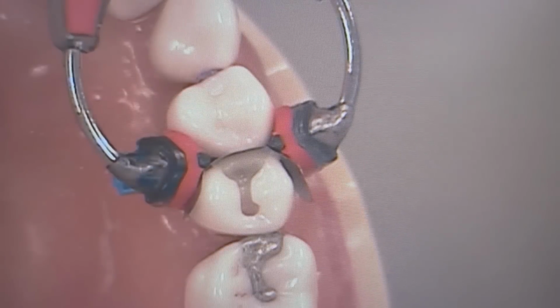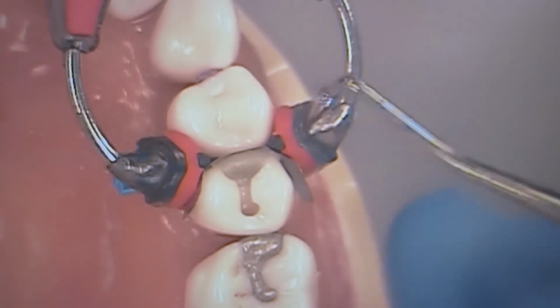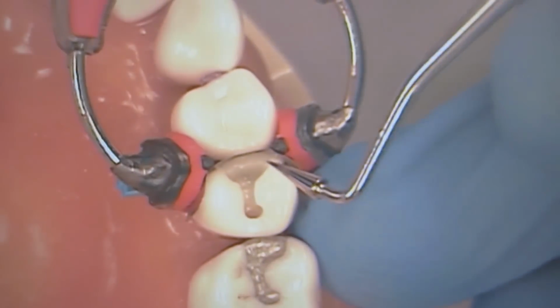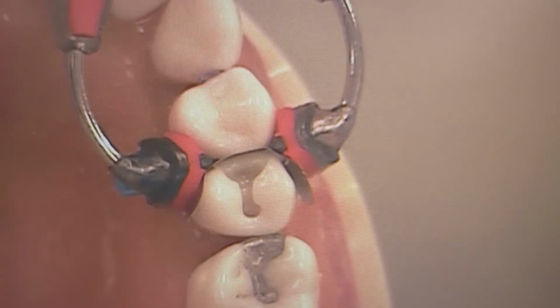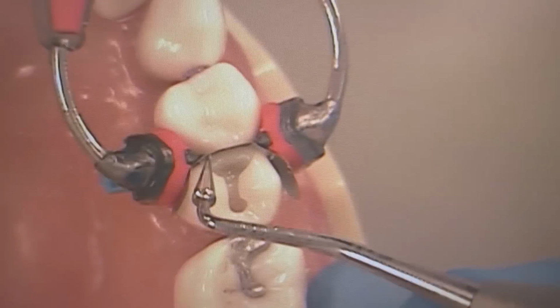What do you use to gauge if your marginal ridge height looks right to you? It's a guesstimation. You're looking at the adjacent tooth. Okay. Dr. Chui is using guesstimation. Using this pointer to remove the excess. Notice that he's pulling with it, not pushing into it.